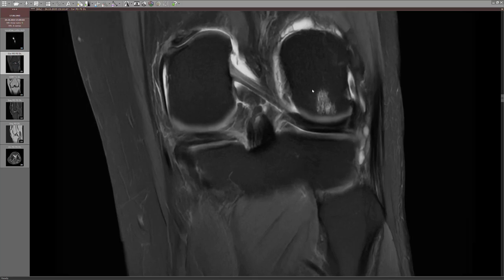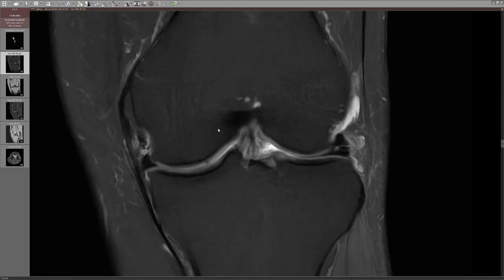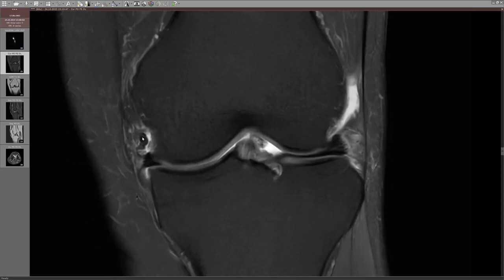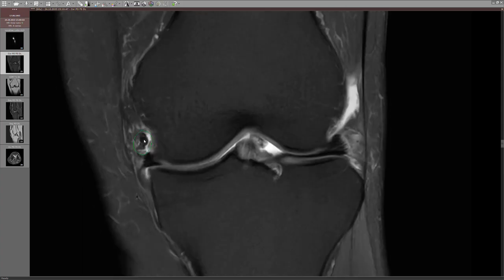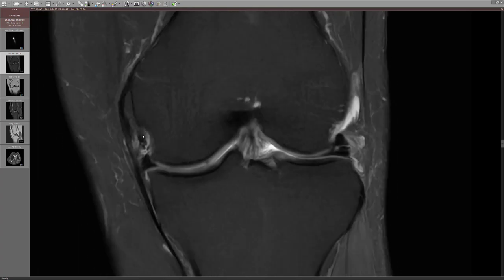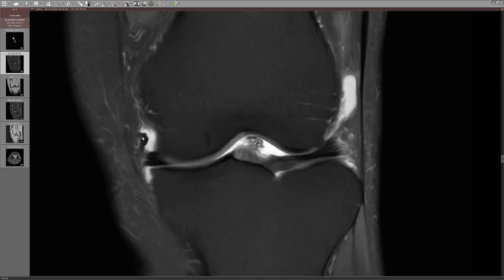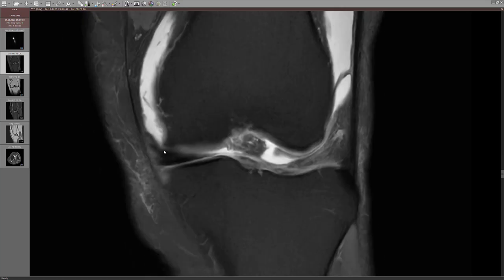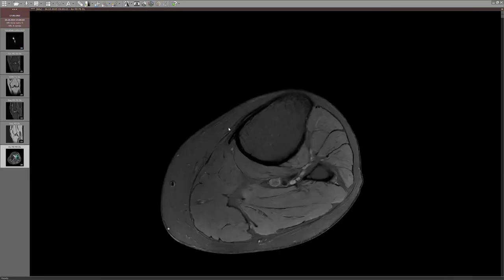What I want to show you from my own practice is this structure here. It's black, it's sitting where we normally don't see anything — you could easily mistake it for a piece of meniscus, a loose body, or similar. But if you scroll through, you can see it has an origin below the MCL, very close or even partially attached to the deep MCL. If you move anteriorly, you see it doesn't go down where it's supposed to — it goes very far anteriorly and then touches down on the meniscus, blending in there.